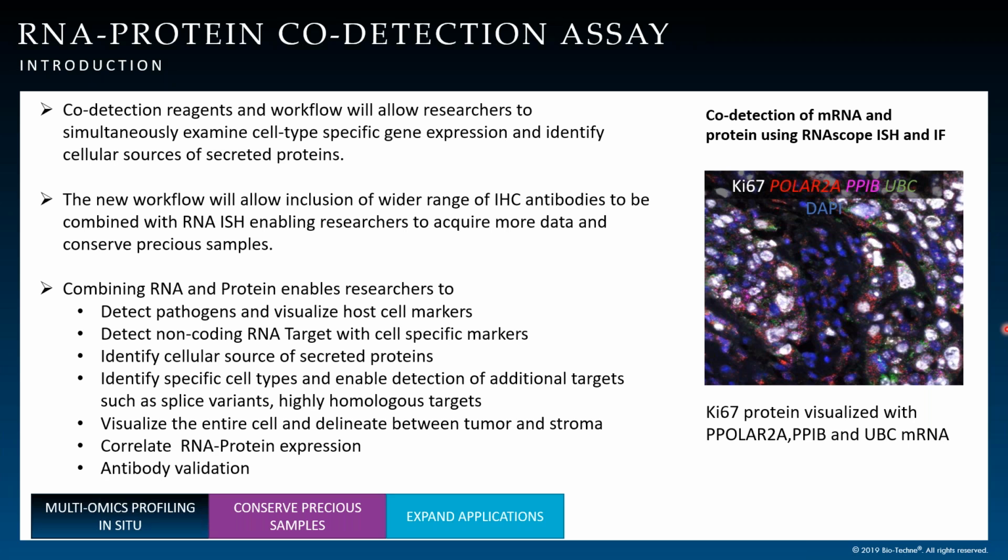And the applications of this particular workflow are endless, where it can be used to visualize pathogen infection and detect host cell markers, or visualize certain non-coding RNA targets in specific cell types, or as you saw in the previous example, detect your microRNA targets in specific cells within tissues of interest.